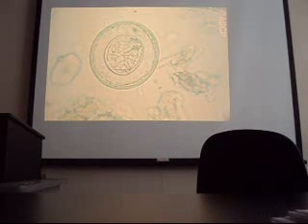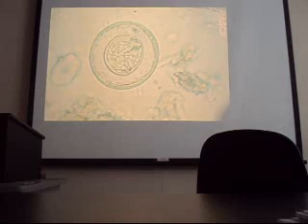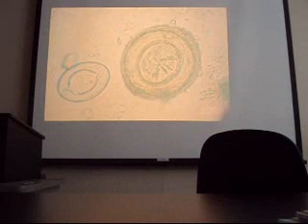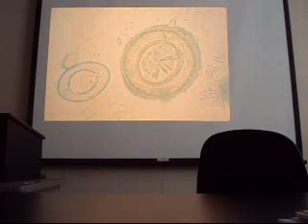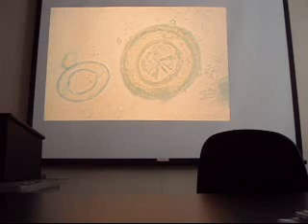Diminuta, this is Diminuta, bigger, thicker shell, bigger egg, and no filaments in this space. Here is Diminuta. This is Nana. Here's polar filaments coming off right there. Diminuta is bigger than Nana.